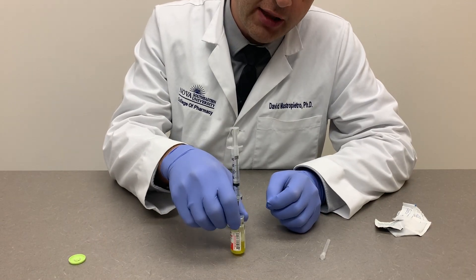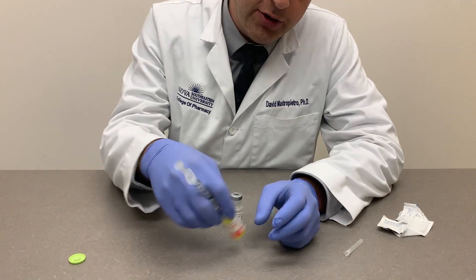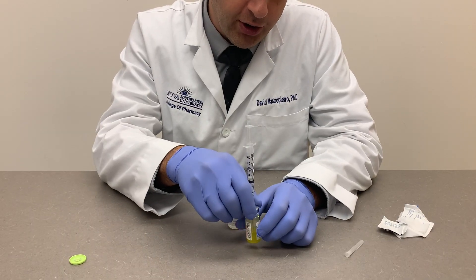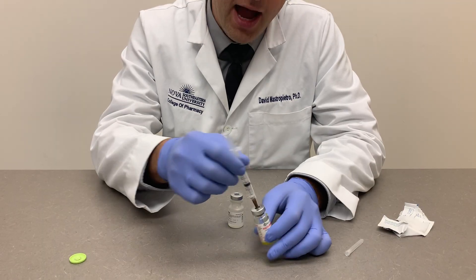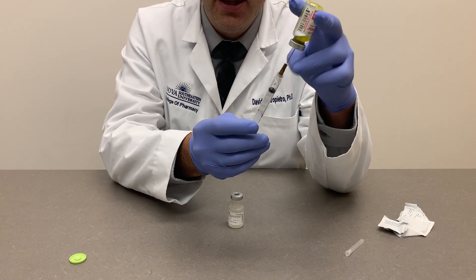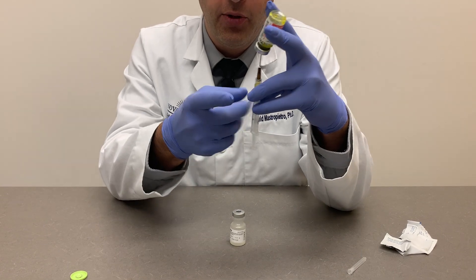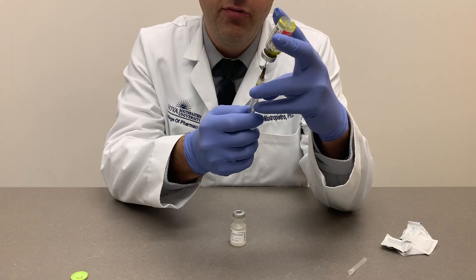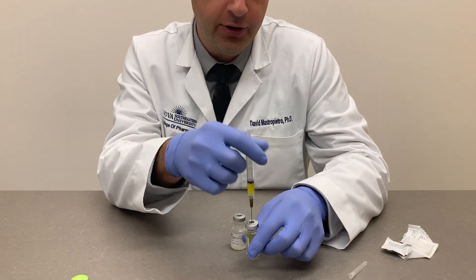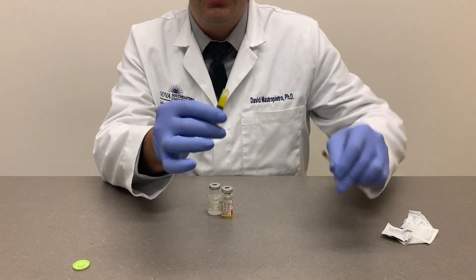Gently swirl the vial to mix. Resist the temptation to shake excessively, as some medications will foam or you can destabilize certain proteins and peptides. Once completely dissolved, keep the needle and syringe in the vial while reconstituting. Pull the needle down so it's in the liquid, then pull back to withdraw up to the 1 mL mark. Remove air bubbles, and once the dose is ready, turn it over, pull back, and use the scoop technique to recap the needle for a different attachment if needed.